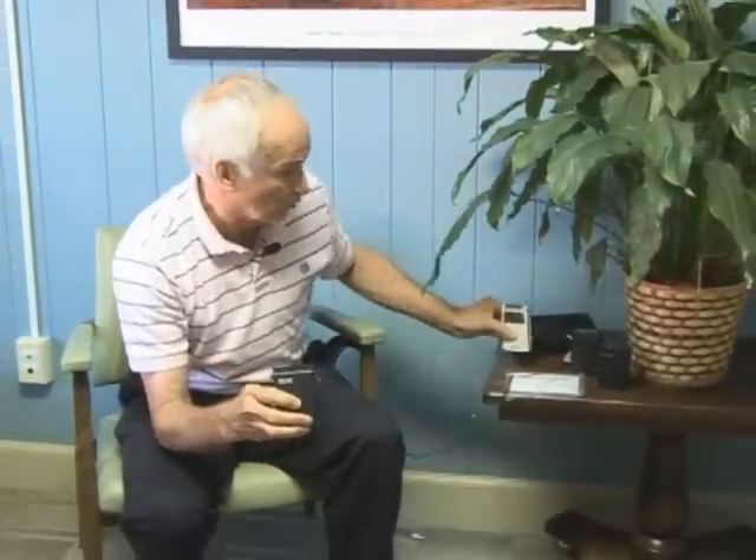Most people, once they start using their analog unit, all they really want to do is turn it on, adjust it to where it feels good, wear it, and wear it for the rest of the day — or through the night if they have pain at night, just go to sleep with it on. That's okay.